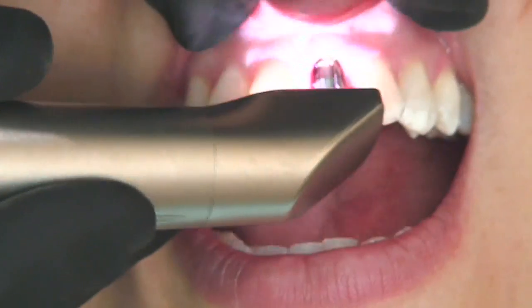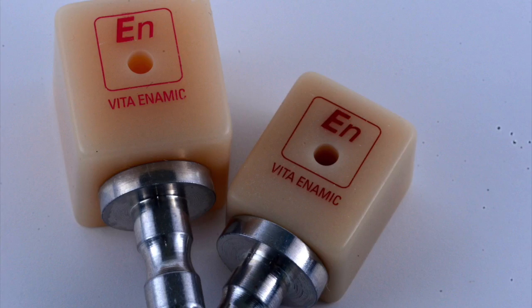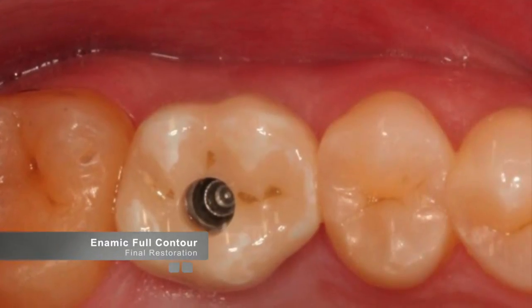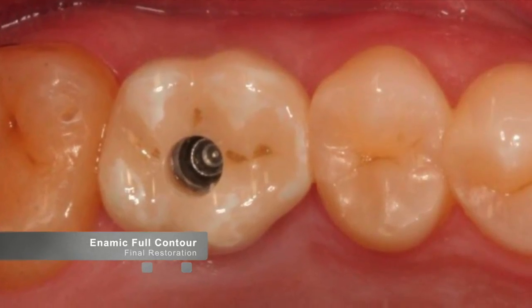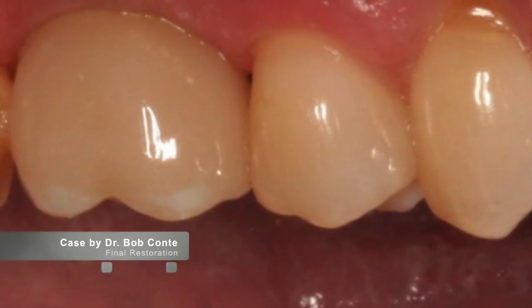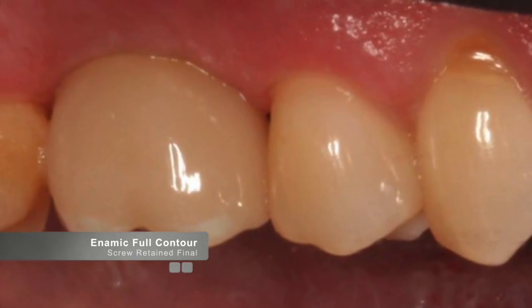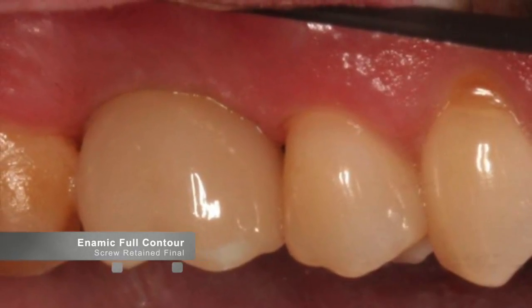The Enamic blocks are available in a size 14 and a size 16. The size 14 blocks are used to fabricate abutments, and the size 16 blocks are used to fabricate full contour screw-retained restorations, both temporary as well as the definitive final restoration. The Enamic IS blocks are unique in that they are the only available block for restoring implants indicated by the manufacturer to be used both as an abutment and a full contour restoration.